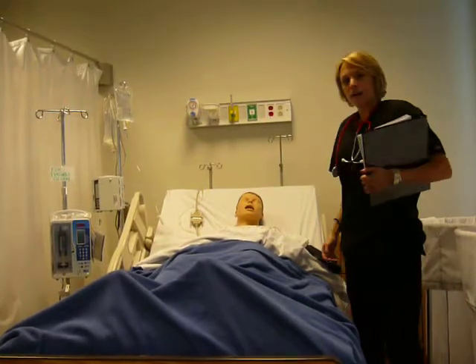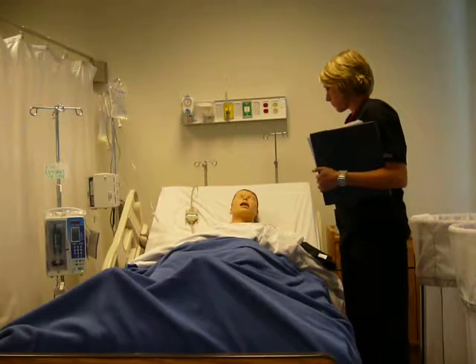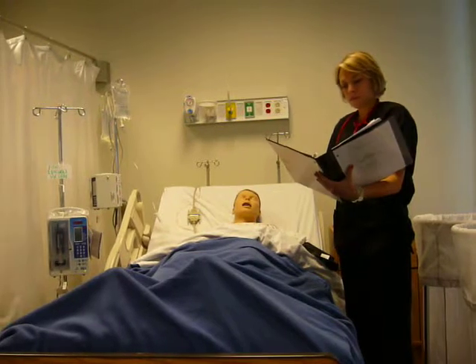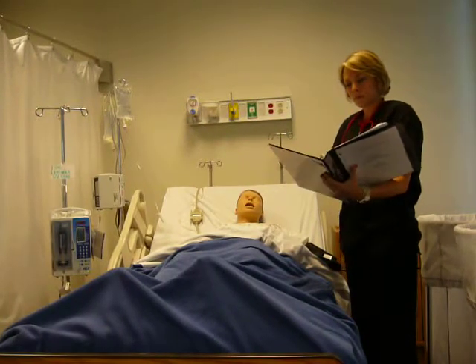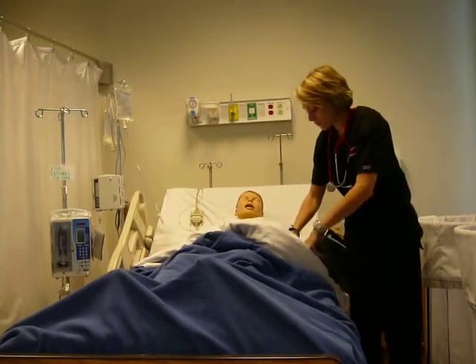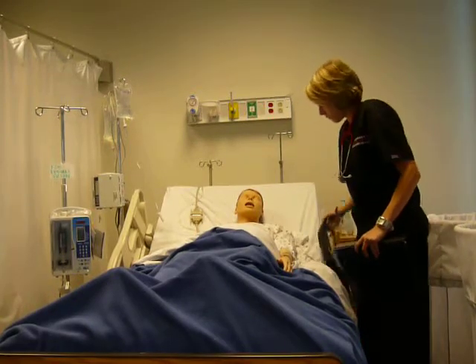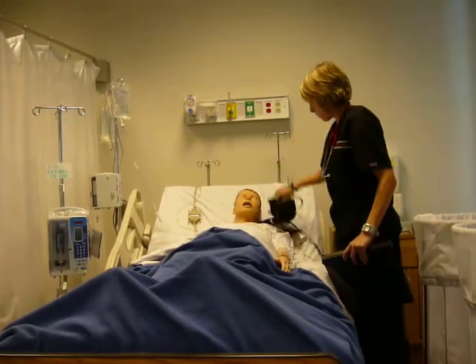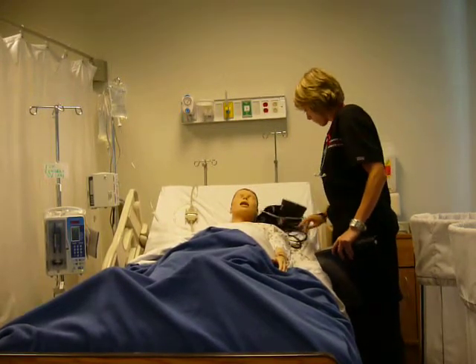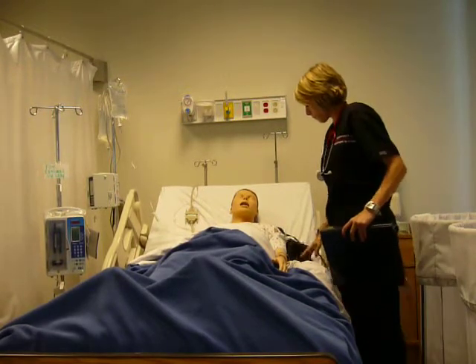So the first thing that we're going to be doing when we have a patient who has an epidural is we're going to check the med order. We're going to check the patient's chart with the med order, and we're going to check for inconsistencies. We're going to make sure that this is the right patient, the right medication, the right amount of medication to be given, the right route, the right dose, and that we're giving it at the right time. So to identify the patient, we're going to be checking their armband with their date of birth. We also want to make sure that these are the same as what's on the order.